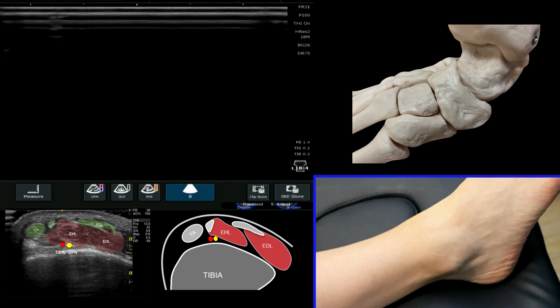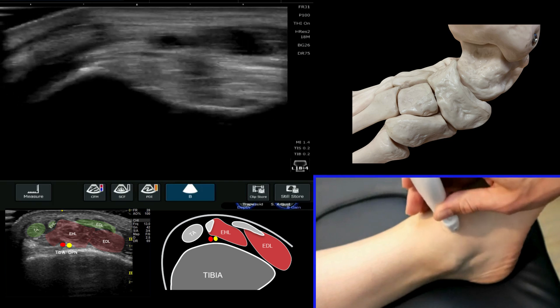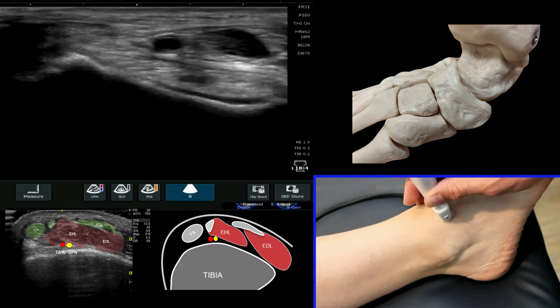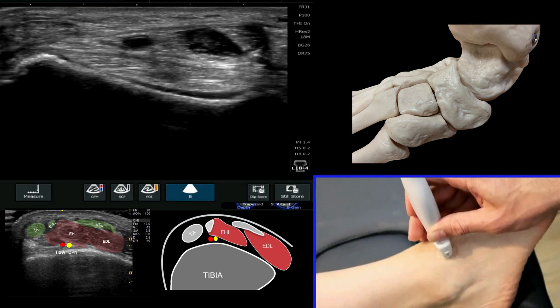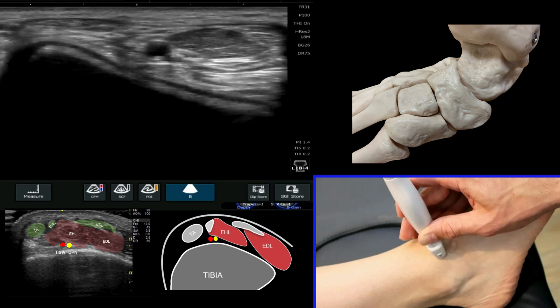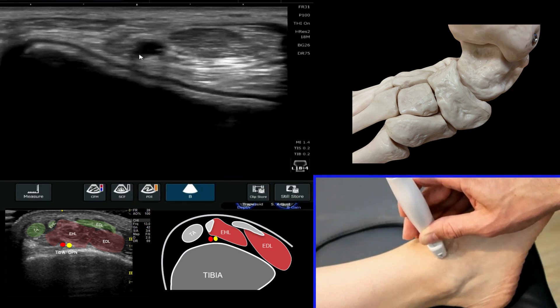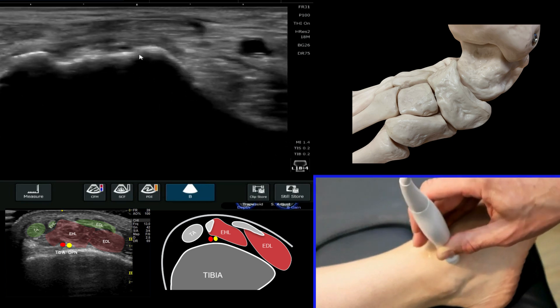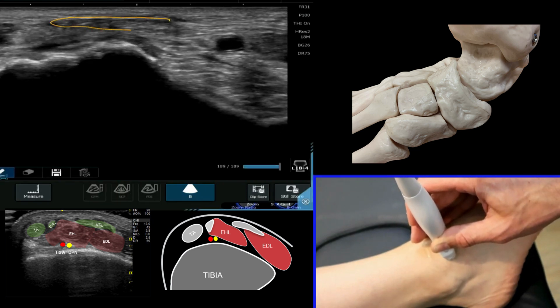At this point you might want to add a little bit more gel, pop your probe back on, and rotate the foot so this is clear when following the video at home. We can again find the neurovascular bundle in the center of the image — I'll use my cursor to help identify that — and then coming around the corner you're going to see a tendinous expanse that's quite superficial, which we can see here across the screen.